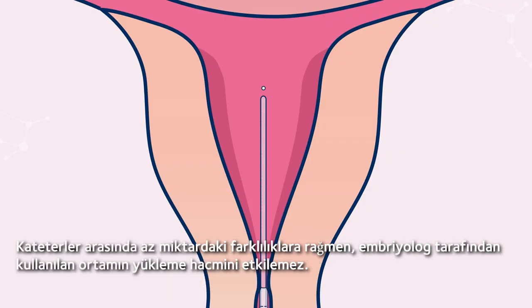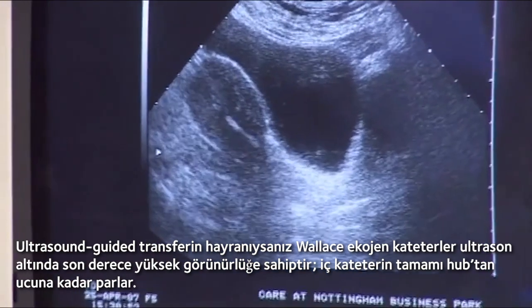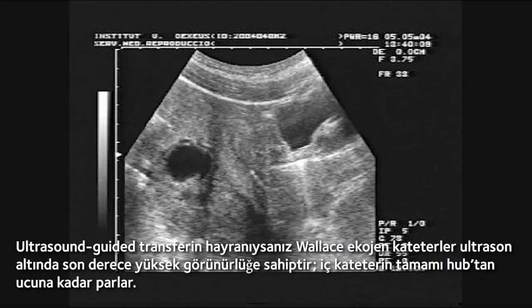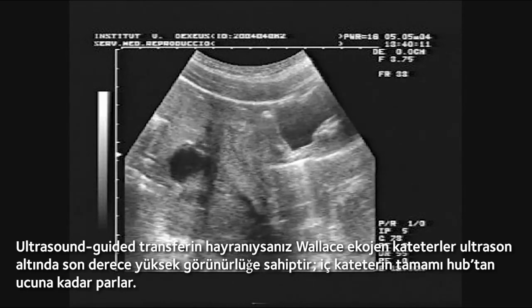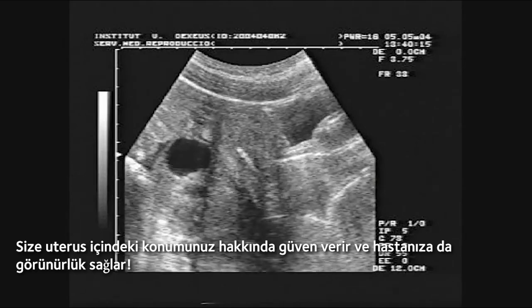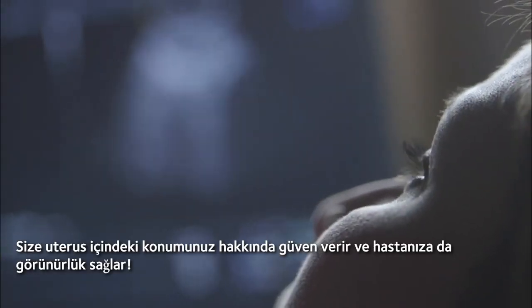Despite the slight differences between catheters, it doesn't affect the loading volume of the media used by the embryologist. If you're a fan of ultrasound-guided transfer, the Wallace ecogenic catheters are highly visible under ultrasound. The entire inner catheter lights up from hub to tip, giving you confidence of your position within the uterus and giving your patient visibility too.